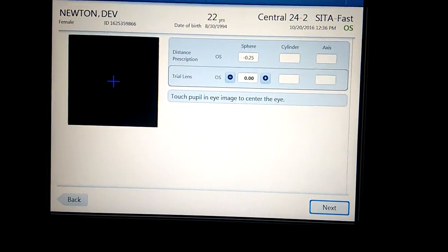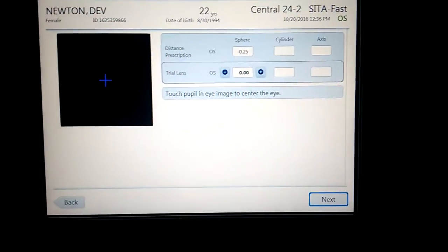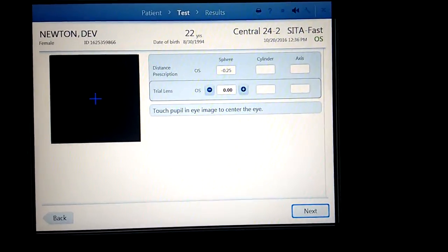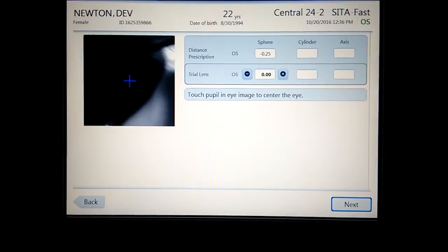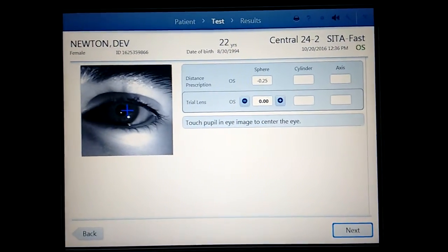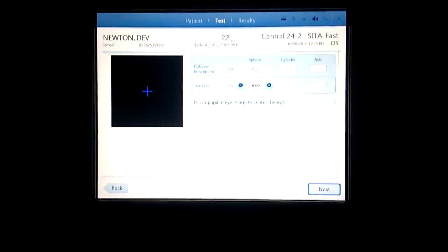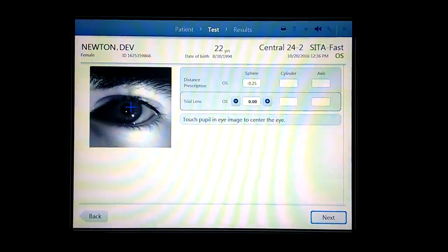So you have to... Okay, do it, yeah, do it. For your fields, done. What is the value, we'll see. Come back. Put the chair on the right. Is right okay? Should I cover it? Okay?